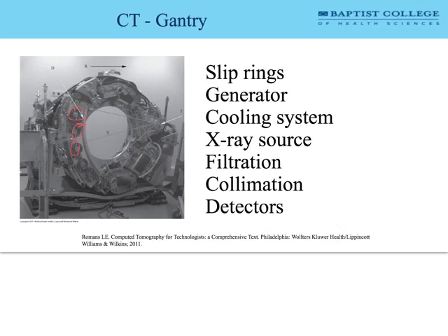Okay? And the box is helpful too, in that it talks about how filtration is going to reduce patient dose and increase image quality. Now, that is what we would call a discussion of inherent filtration. Sometimes we talk about added filtration, and a good example of that is the bow tie filter.